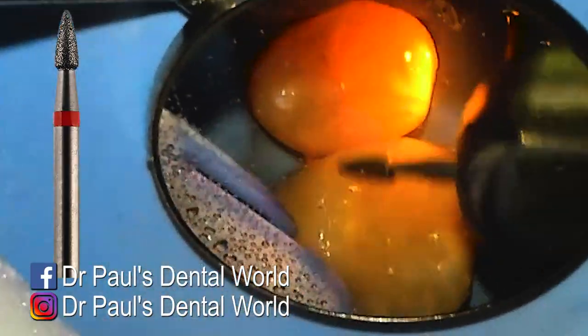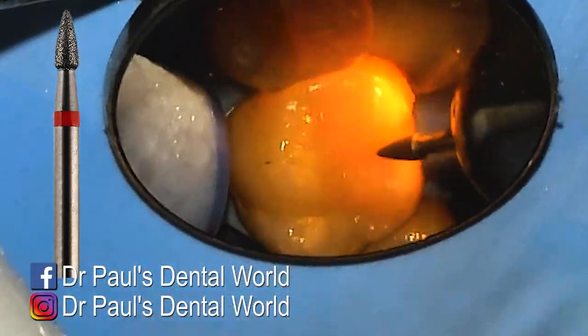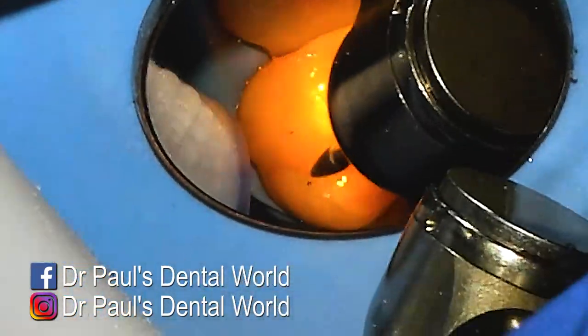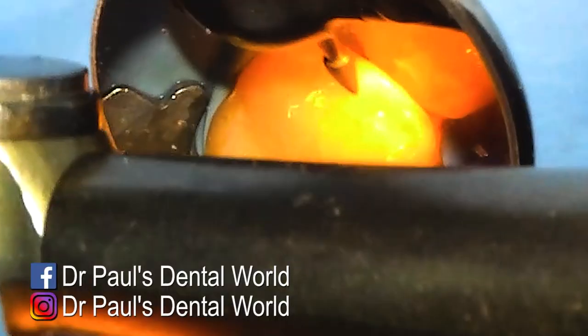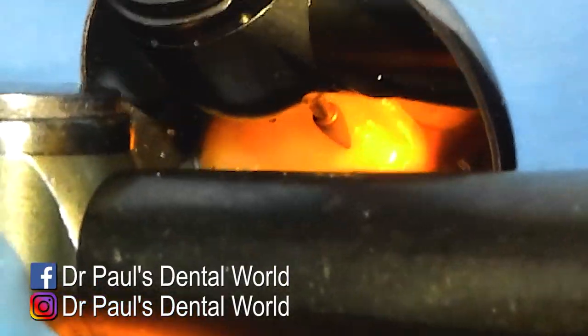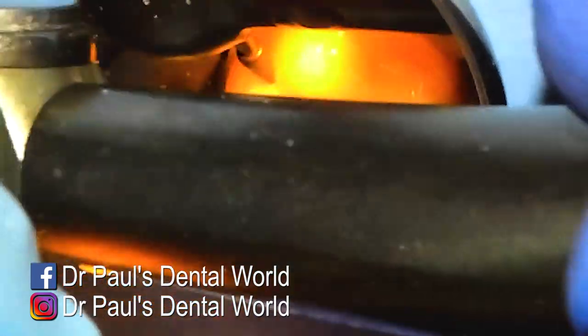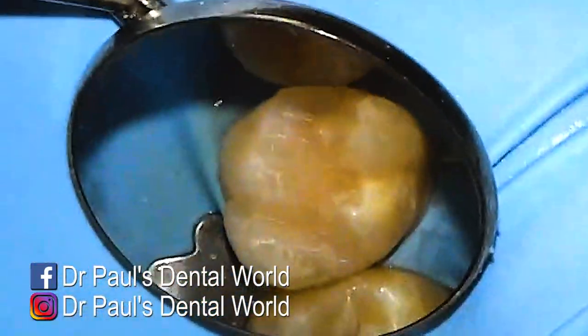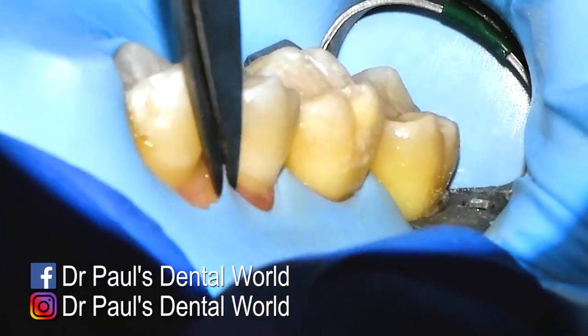Once I've done that with my coarse flame burr, I'll do the same thing with a polishing version — a red band one — going over the same bumps and grooves in the same fashion. This one is less about taking things away and more about smoothing things off. Once I've done my gross reduction and I'm happy with how much I've reduced, I'll go over it and the shape's actually looking quite nice.